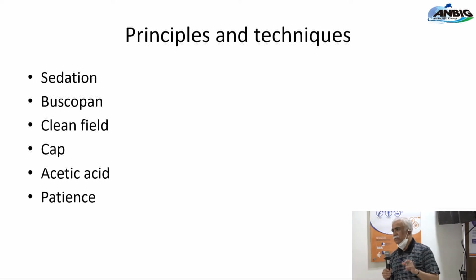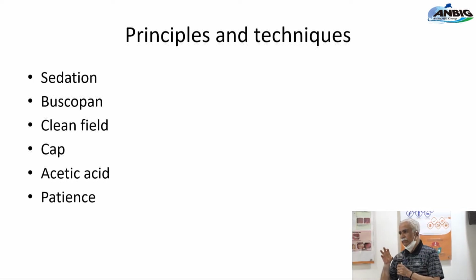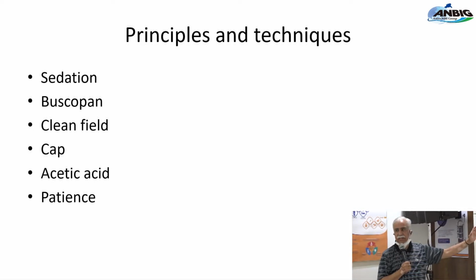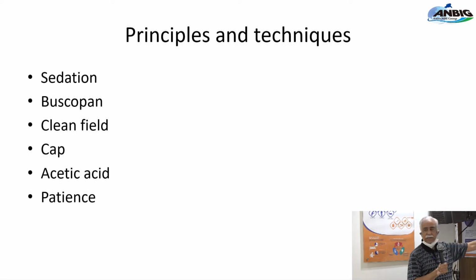A clean field means the patient has to be fasting. I discussed this last night. We must have a patient who's adequately fasting, nothing in the stomach, maybe a pre-endoscopic drink of simethicone with, obviously, acetylcysteine, which does make a difference. We usually use a cap when we are doing this so that we get a good focus. I will talk about this again. Acetic acid is something I keep in my unit, and we'll see why during the procedures, but this is important.